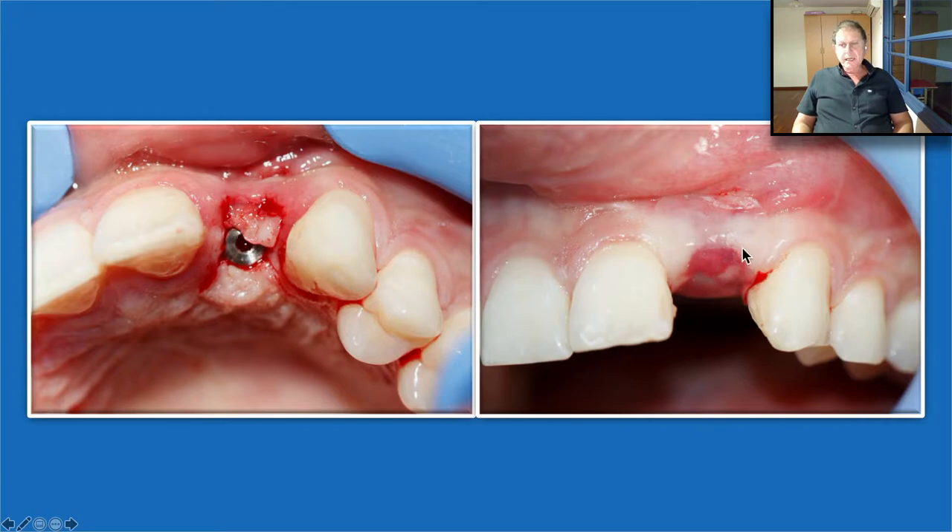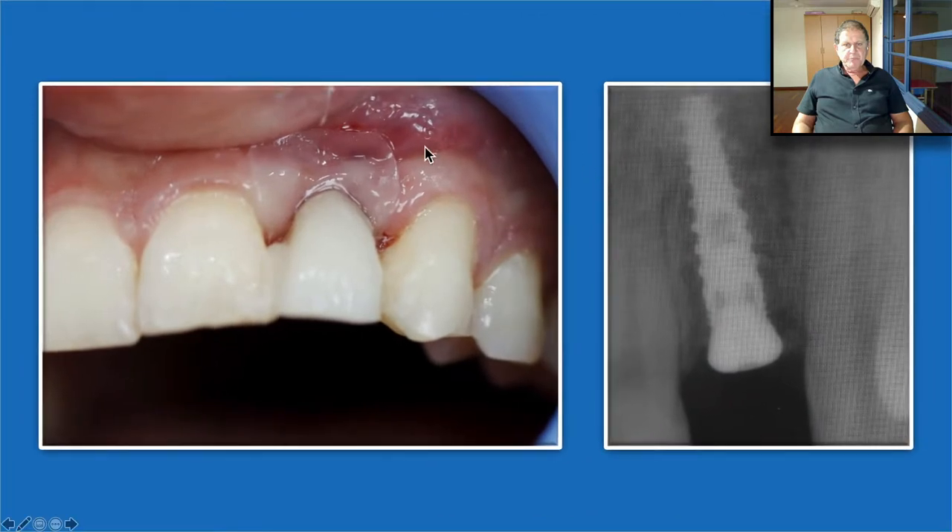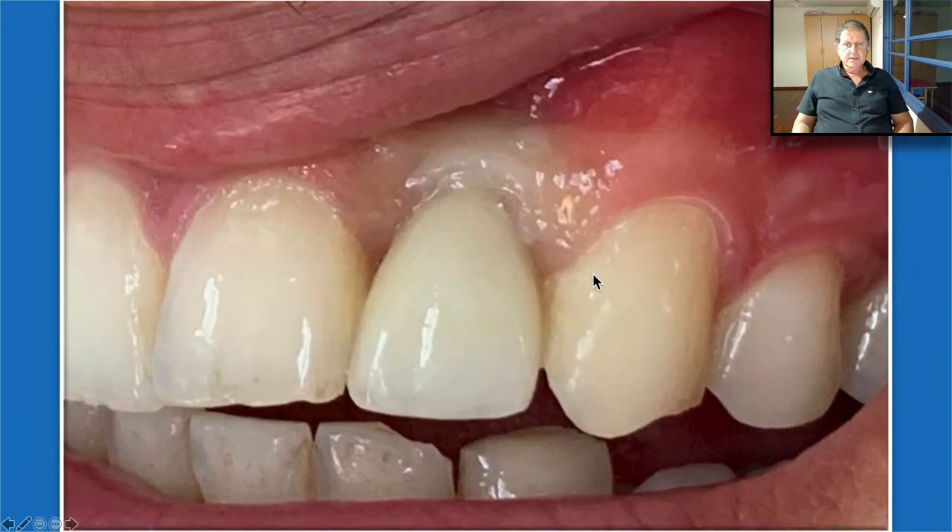We again place the Oraid because we like to protect the site after every surgery. That's how it looks with the provisional. That is the radiographic appearance, and that's the final result. I think it's a wonderful result and wonderful soft tissue healing.